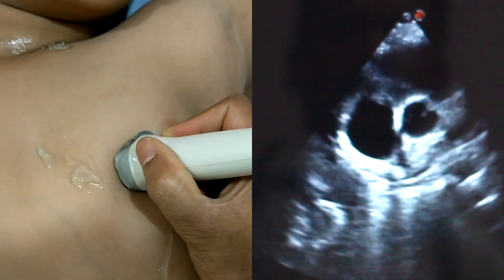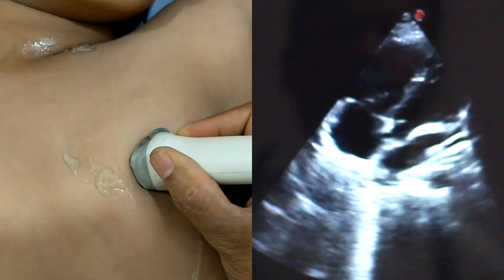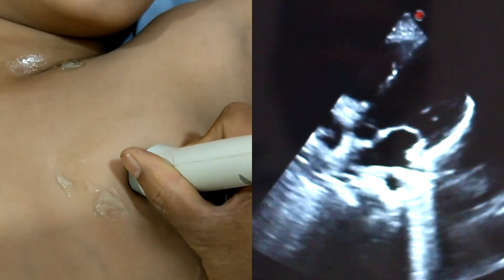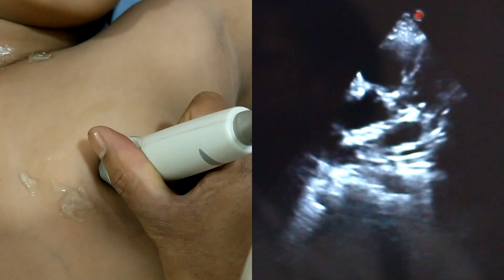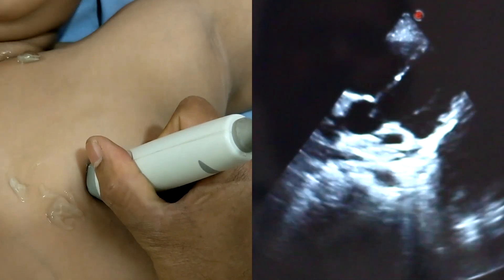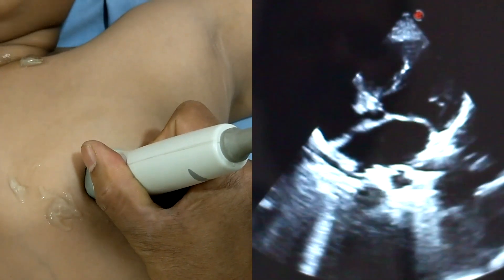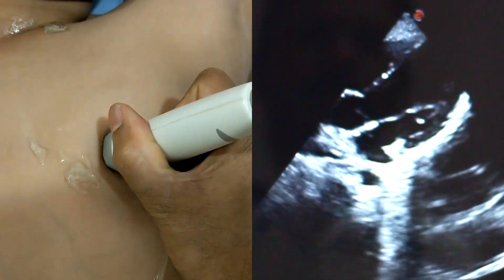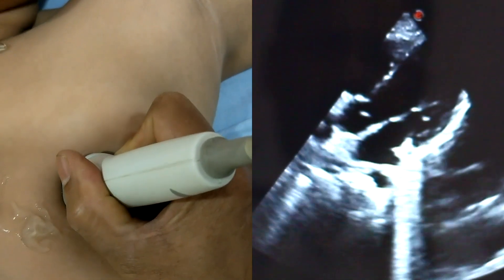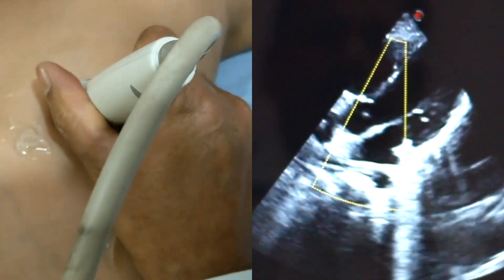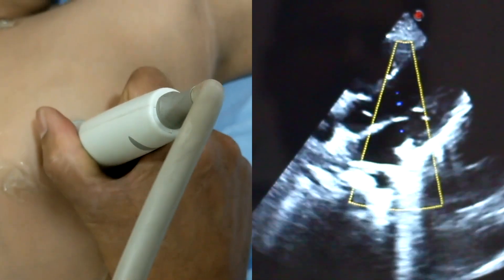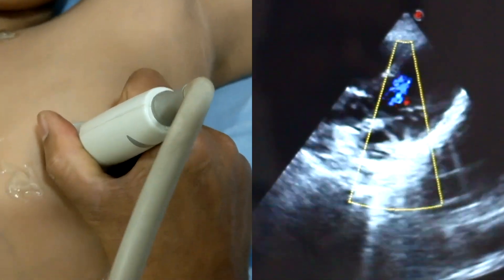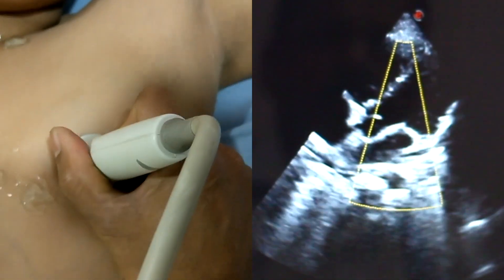Here I am showing the aortic valve, left ventricle, and mitral valve with very clear resolution. Getting the maximum resolution from ultrasound is very important. This is operator-oriented — repeated learning and performing a high number of procedures and gaining more information will make you more proficient in echocardiography.